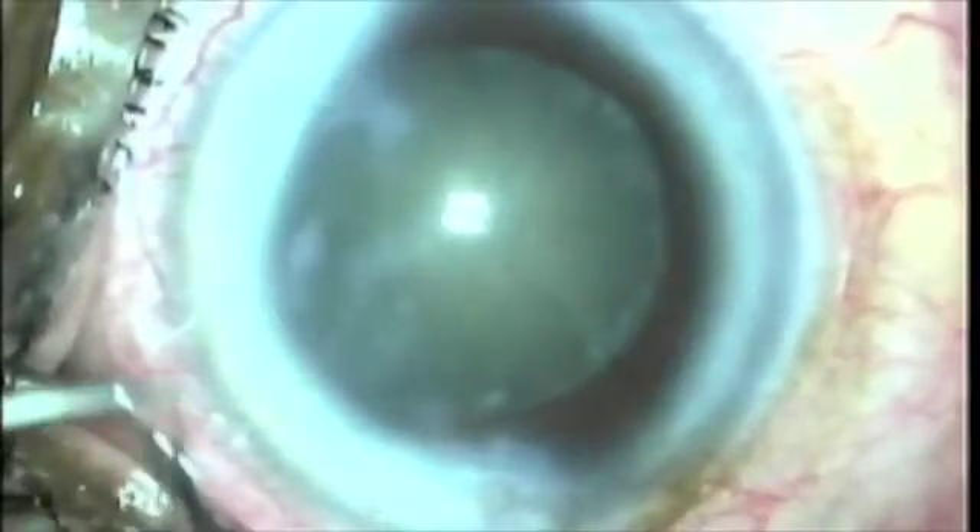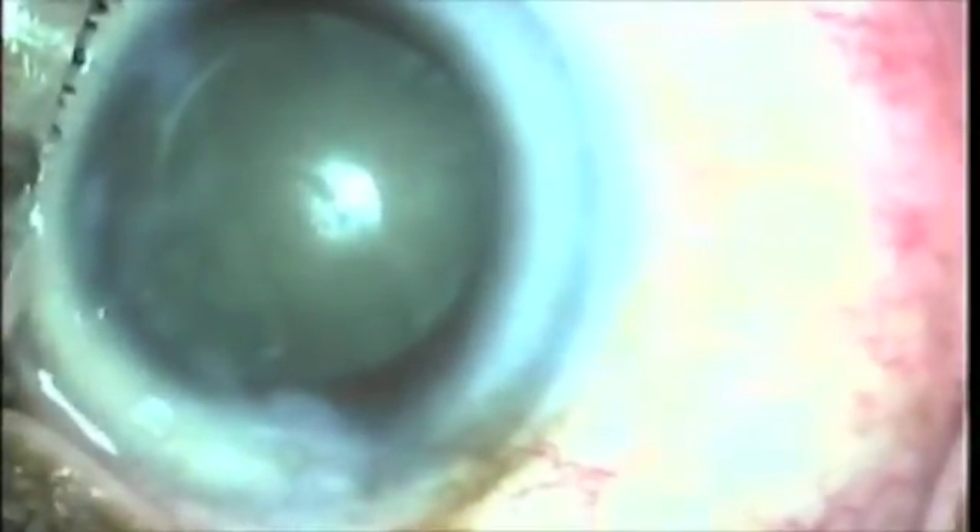Here you can see that there is beautiful centration of the IOL. After three or four weeks, there's that haze of the anterior capsule rim that almost comes up to the peripheral edge of the optic. Remember, we had made this real large capsulotomy two millimeters from the limbus, yet there's such high convexity peripherally of the lens that you still get a beautiful area and great centration.